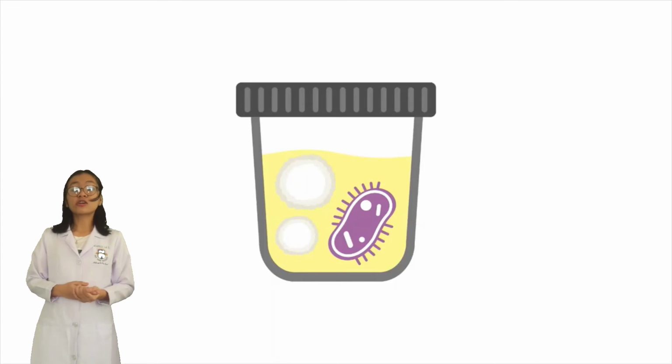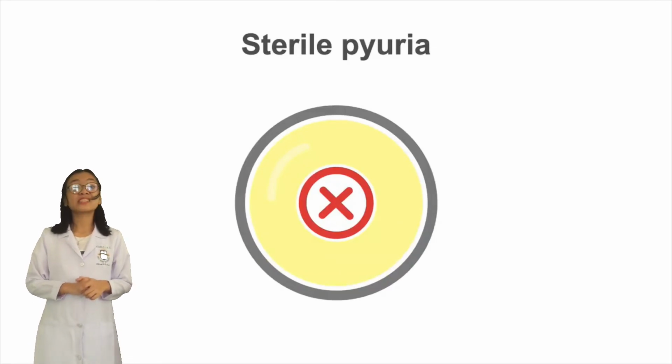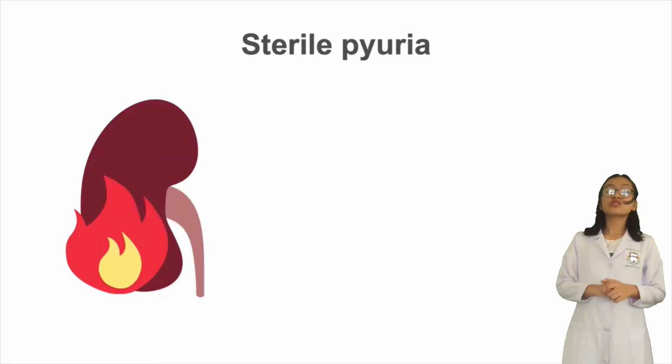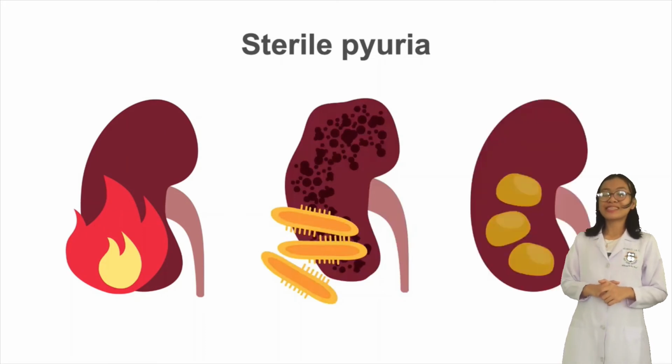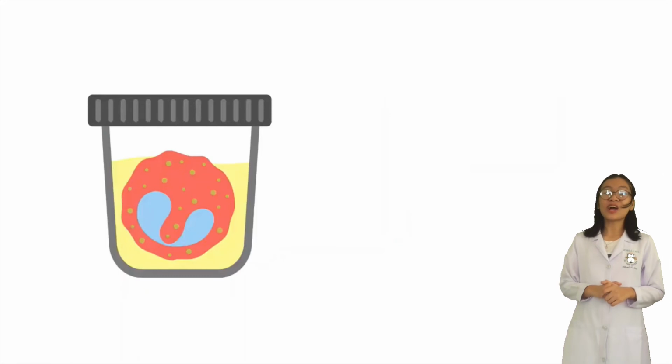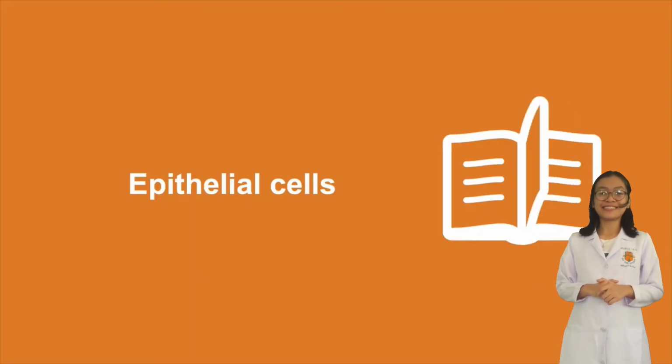White blood cells in the urine include neutrophils and eosinophils. Urinary neutrophils are commonly associated with bacteria. However, if the corresponding urine culture is negative, which is known as sterile pyuria, then interstitial nephritis, which is the inflammation of the interstitium of the kidney, renal tuberculosis, and nephrolithiasis should be considered. The presence of eosinophiluria has classically been considered a marker of acute interstitial nephritis.